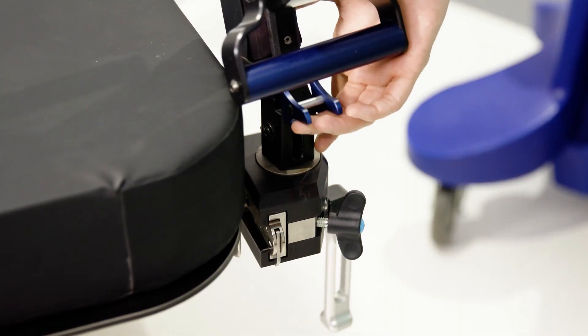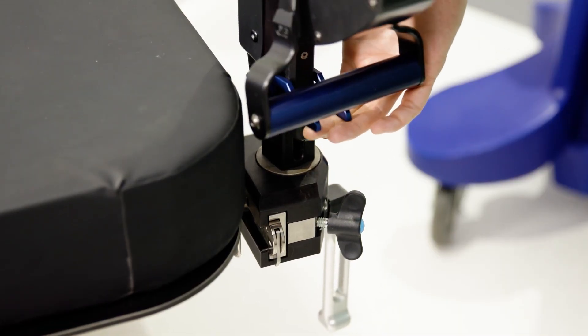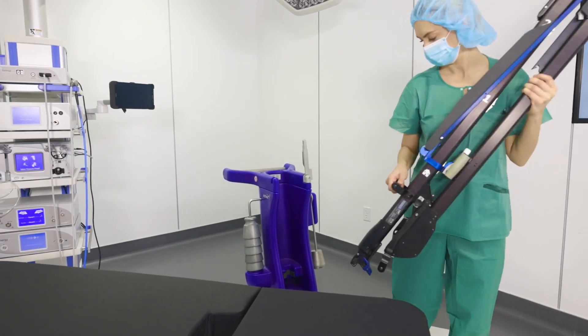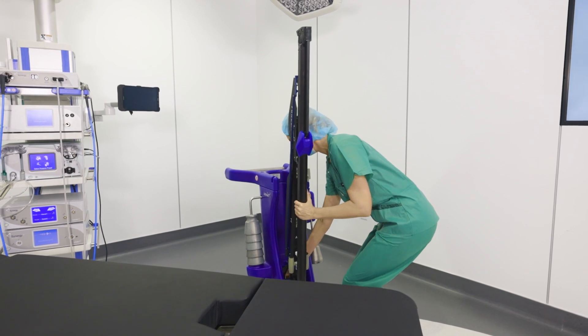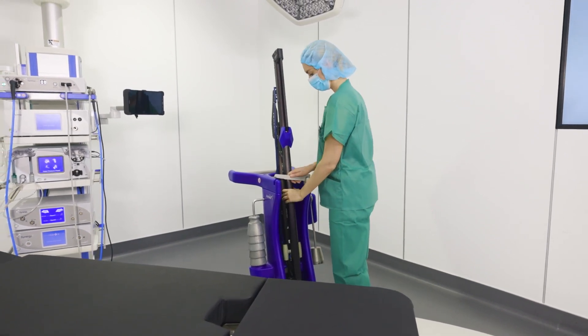Press the blue safety lever at the bottom of the tower while tilting the tower back, then lift it from the rail clamp. At 16 pounds, the tower is light enough for any staff member to maneuver from the OR table to the storage cart easily.